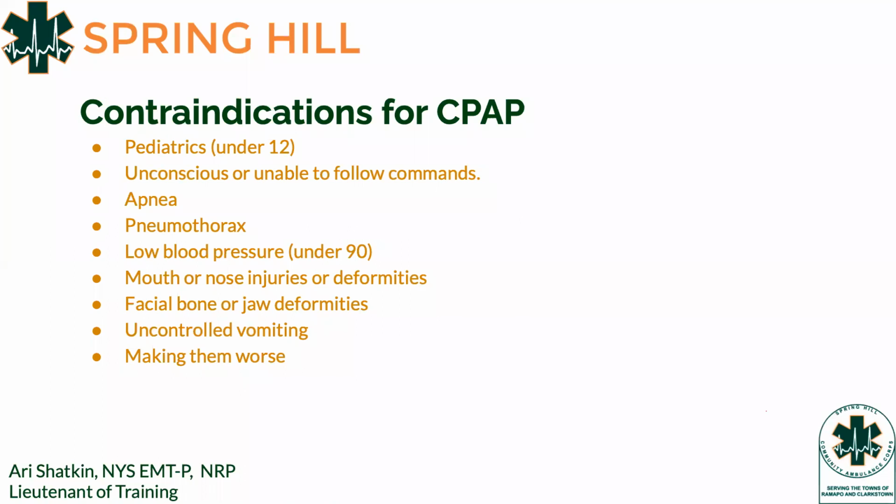So the patient being unconscious or unable to follow commands means that they're not going to be maintaining their own airway. Therefore, they're not a candidate for CPAP. Apnea: you have to be able to spontaneously breathe in, but most importantly, spontaneously breathe out to use CPAP, or else it will just keep forcing air in and nothing's going to leave, which is not productive.